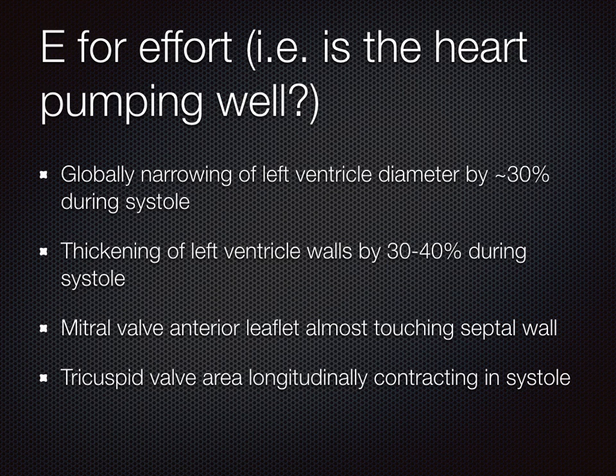So E is for effort. So really this is, is the heart pumping well? So when we're looking at this, we just want to see, is it pumping well? And we know that there's some criteria that we've covered in our podcast that may help us.